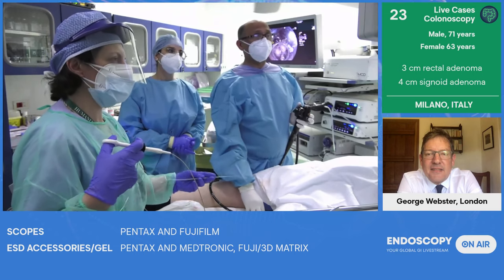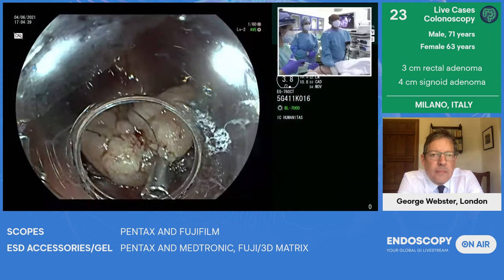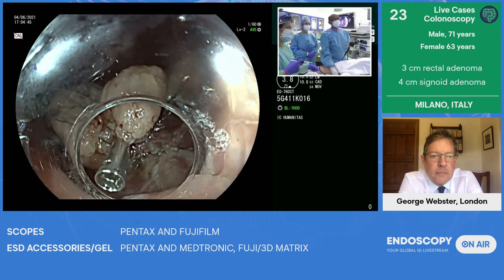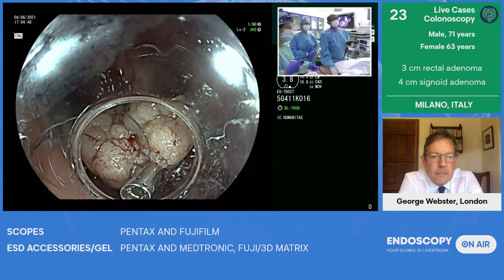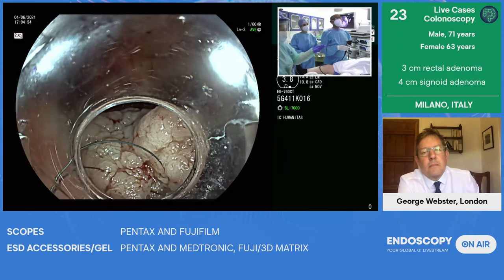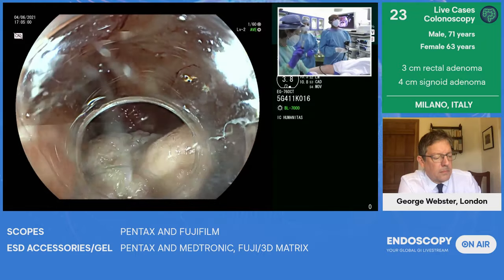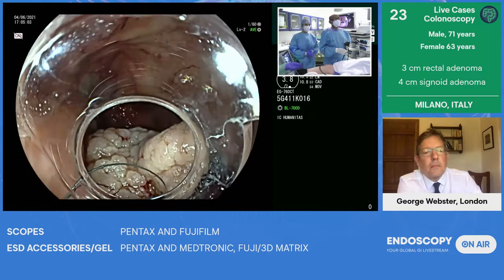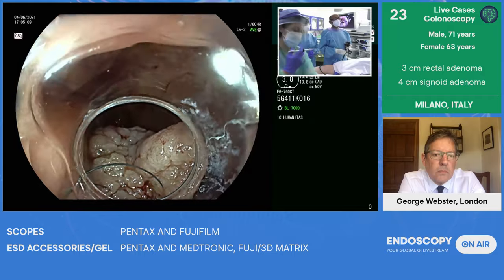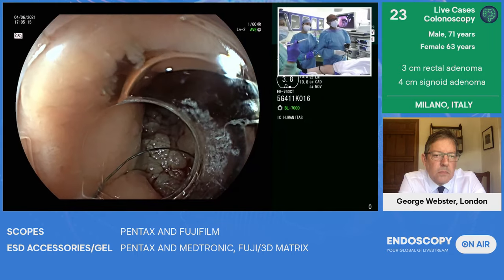So what I have here is a Prodigy traction wire from Medtronic. You see a clip there. One arm of the clip has this metal wire attached to it. So I've just created a little flap, attached this clip along with the traction wire, and now I'll use a second clip and pin this traction wire to the opposite wall, George. And that will pull it open. This is like how surgeons have their assistant holding retractors and opening the planes for surgeons to drive their knife. That's more or less the same thing now for the endoscopist.